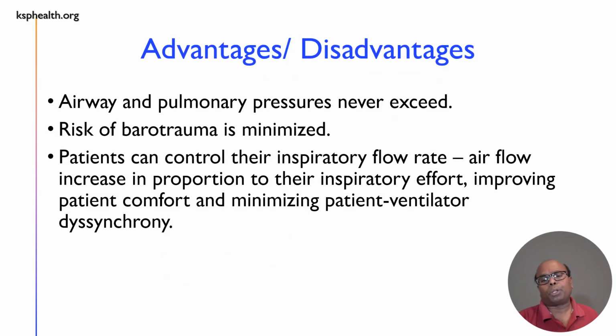The advantages of preset pressure, or pressure control or assist control pressure control, is airway pulmonary pressure is never exceeded because you preset it. So risk of barotrauma is minimized. And another advantage of having pressure control or pressure assist is the patient can control their inspiratory flow rate. The airflow increases in proportion to their inspiratory effort, improving patient comfort and minimizing patient ventilator dyssynchrony.